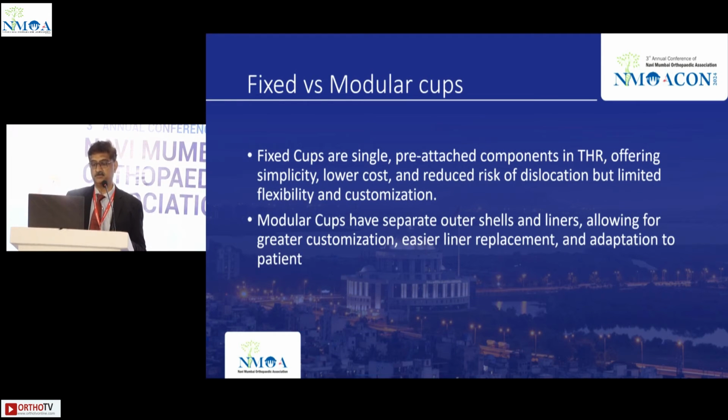Fixed versus modular cup. Fixed cups are single, pre-attached components in THR, offering simplicity, lower cost, and reduced risk of dislocation, but limited flexibility and customization. Modular cups have separate outer shells and liners, allowing for greater customization, easier liner replacements, and adaptation to patients.